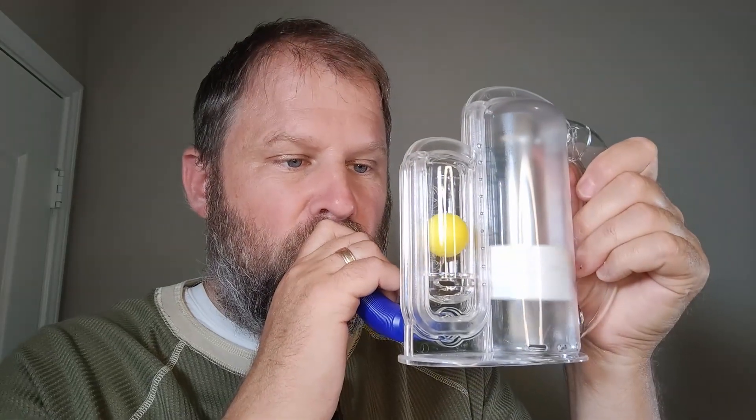Just slowly raise that disc all the way to the top and then hold it for a second. Okay, here we go again. Oh, I can feel it — I can feel it expanding my chest. My lungs are definitely getting some exercise.